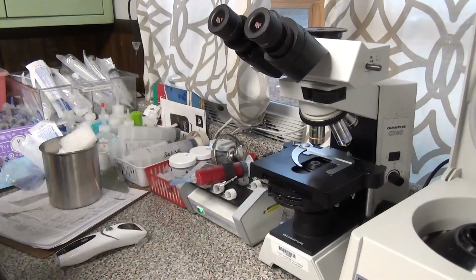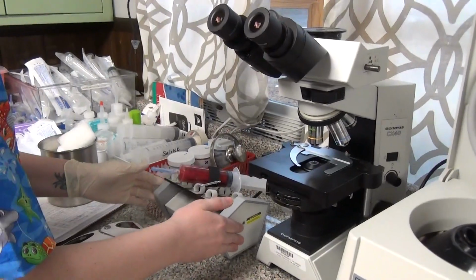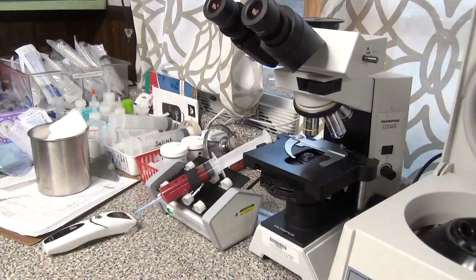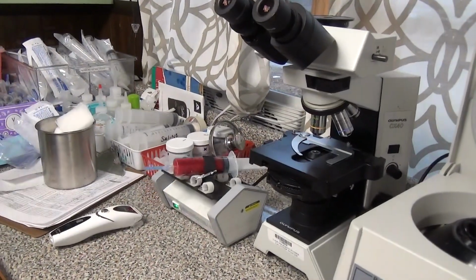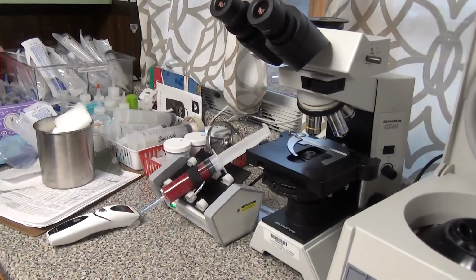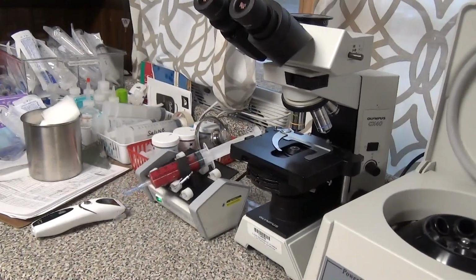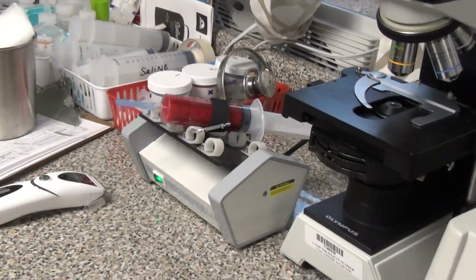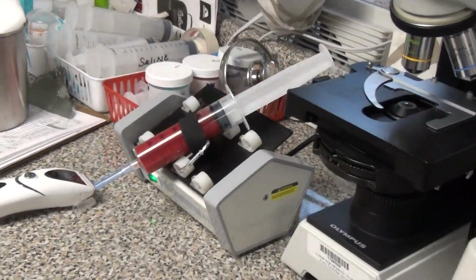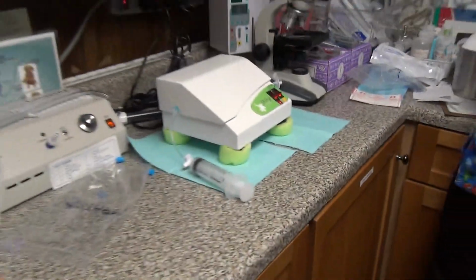So now she's putting it on a tube rocker, just to gently keep the blood rocking back and forth, mixing with the ozone as she gets ready to do the procedure. If you're rocking it back and forth by yourself, you don't need to have this, and be doing at least 20 times where you're rocking it, so it's getting mixed well into the ozone. And so she was rocking it before, so that should be fine now.